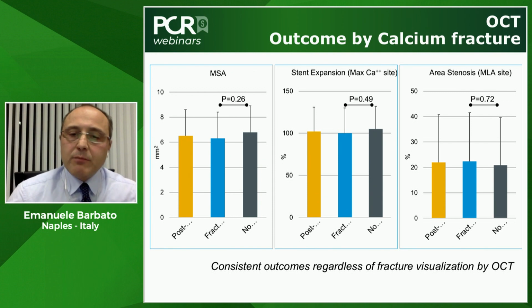So, Michael and Benjamin, we had a nice overview. I think we can take the slide out. We had a nice overview of the data coming from DISRUPT CAD III. We discussed safety, efficacy, and the mechanism at large. But there are several concerns raised by colleagues in the community. One concern that keeps coming back, Benjamin, and this is for you to address, is the possible arrhythmias induced by intravascular lithotripsy. There is even one colleague questioning the length of QT before delivering the shocks, and another colleague afraid of ventricular fibrillation. Can you give us some words of reassurance here?